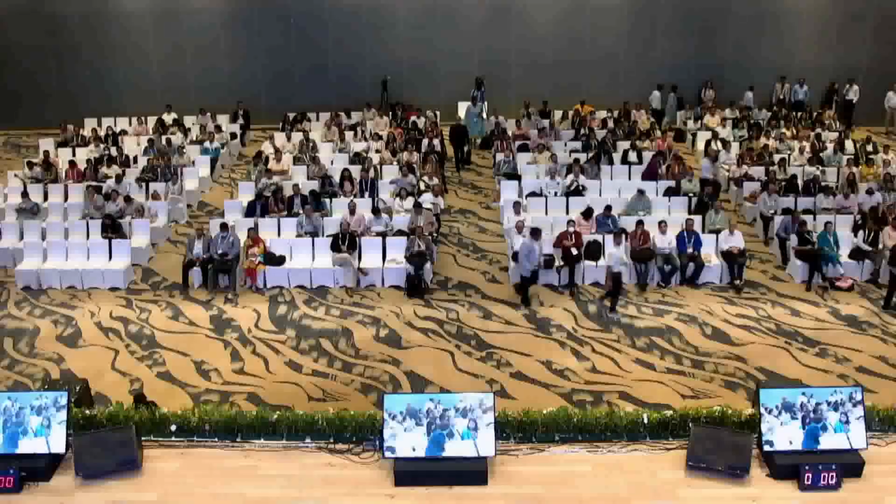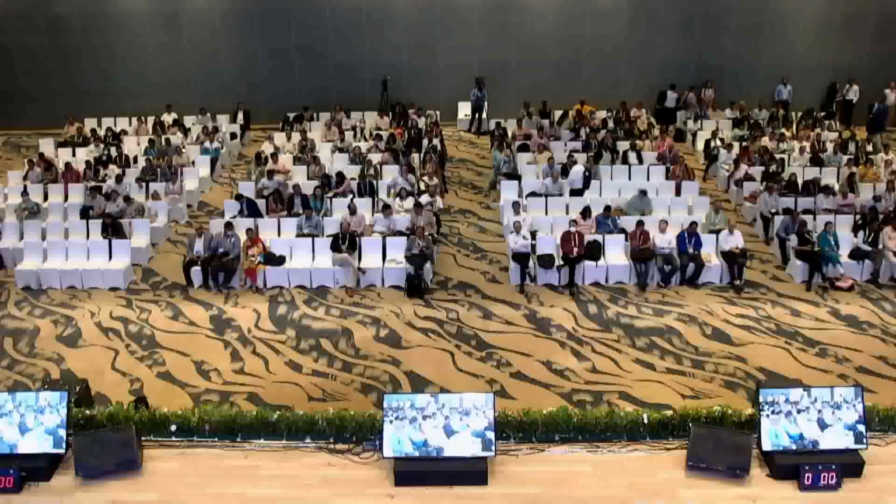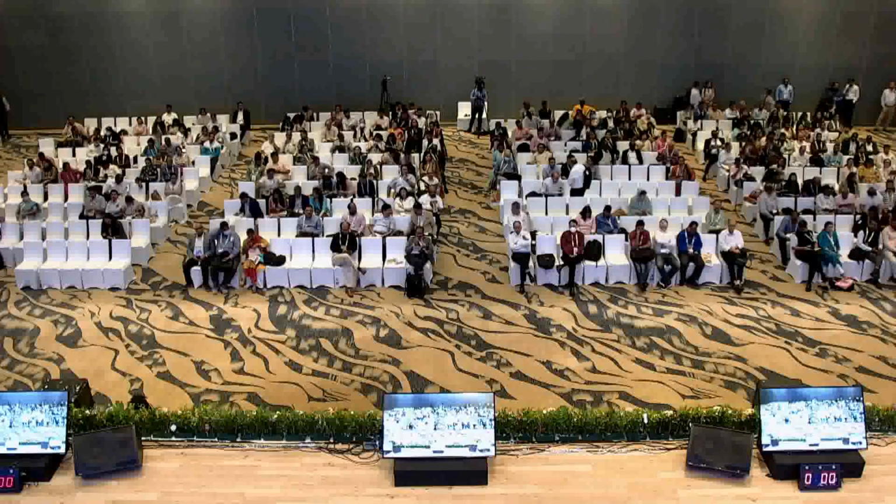Thank you so much, Professor Lahane. It was a wonderful session on SICS, and one must consider monovision in giving bifocality to the patient, which is very essential. It's very cheap, and you can easily give 6/6 or 6/9 vision in the dominant eye, and in the other eye you can make them myopic, and you will not need glasses most of the time. So this is what you can add with the SICS, and one can do a wonderful job with the SICS. Thank you so much, sir.